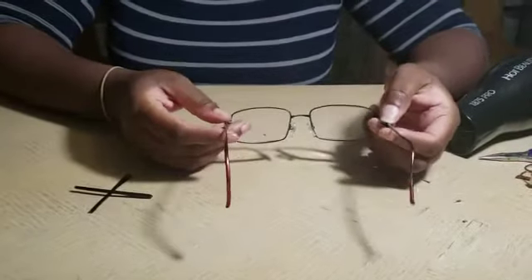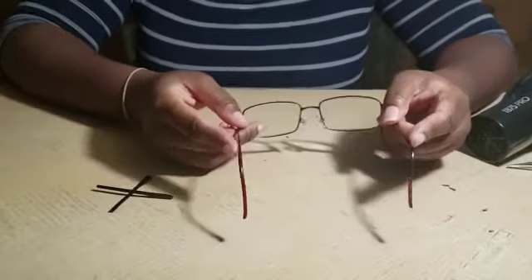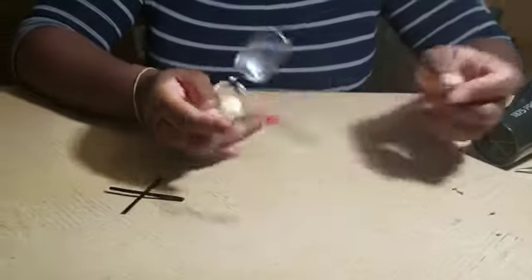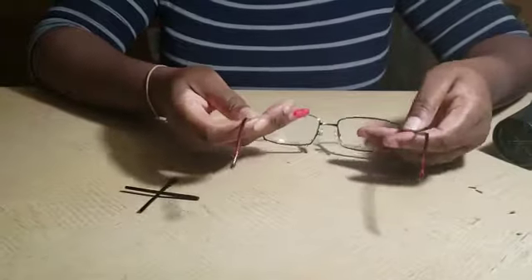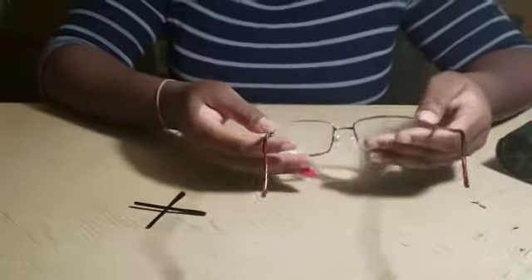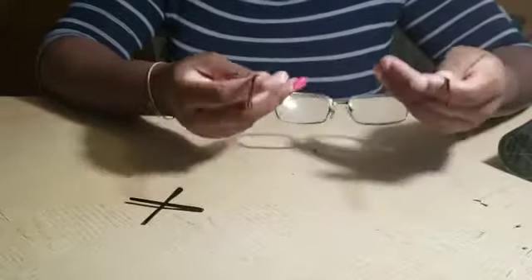We will be removing and inserting new temple tips. These are the temple tips of a temple — they cover the actual temple so that when the patient or wearer is wearing the glasses, the temples don't poke them.